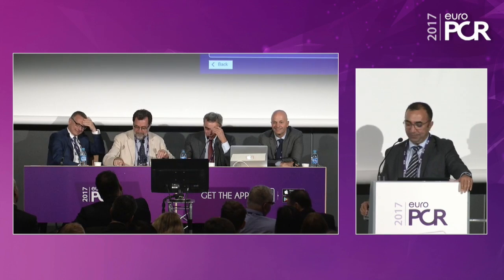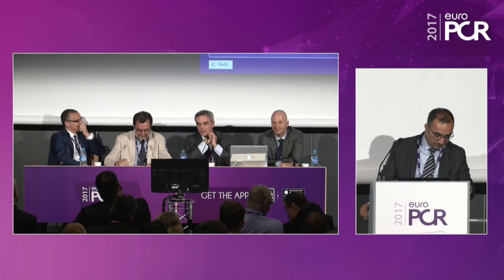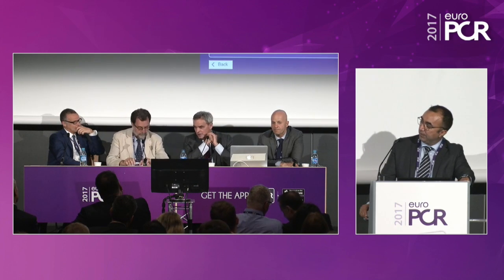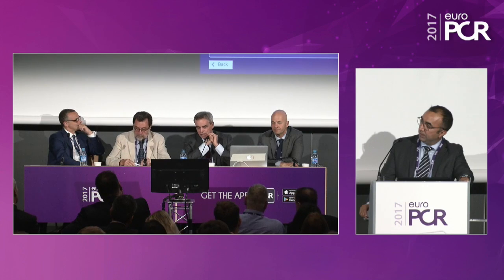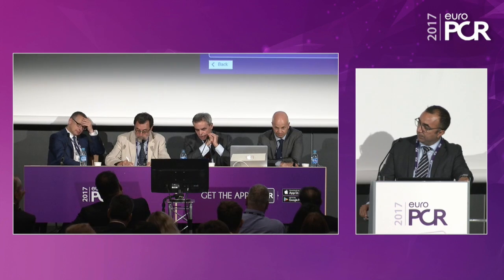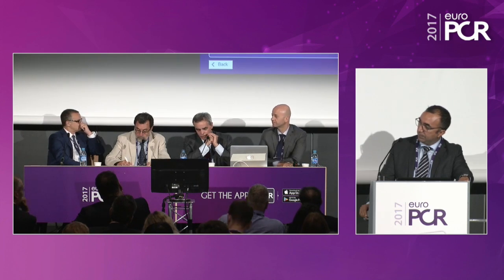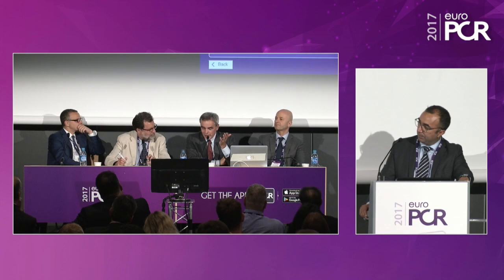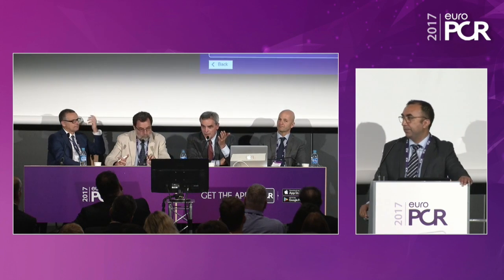Karl-Heinz. You know, when we started this program, of course, we were also looking at what we thought is the ideal candidate. And that is very much what Francesco described. Of course, a large annulus and not too much tethering and a spherical enlargement of the LV. However, the issue is, and therefore it's so difficult for me to answer that question, that as Francesco showed, even if you look into smaller annuli, and if you look into severe tethering, you also have very nice responders.